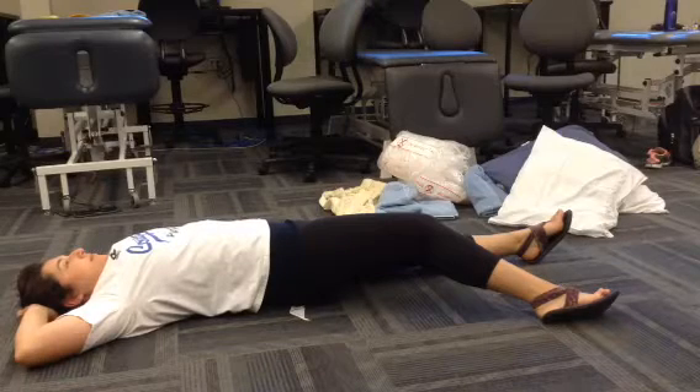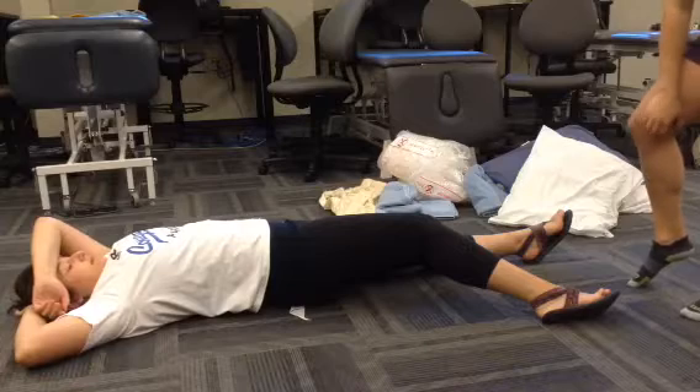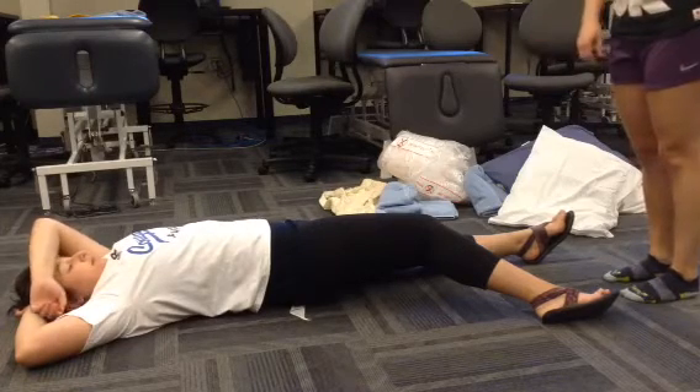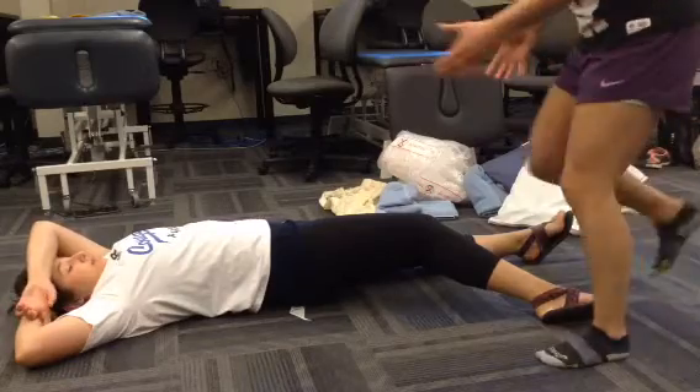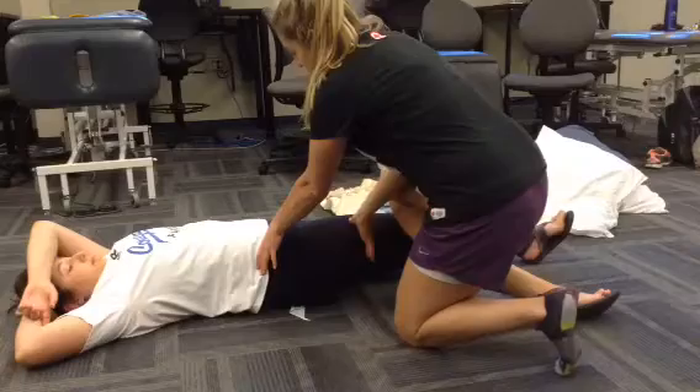This is an anatomical splint for a posterior hip dislocation. The first thing I would do is get my helper to manually stabilize above and below the joint, landmarking on the ASIS and just below the greater trochanter.